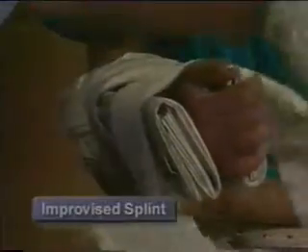A splint is any device used to stabilize a fracture or dislocation. Improvised splints can be made from such items as a newspaper, a magazine, a pillow, heavy cardboard, wood, or a folded blanket.